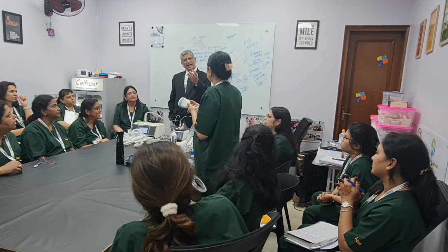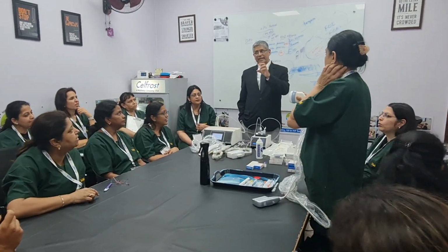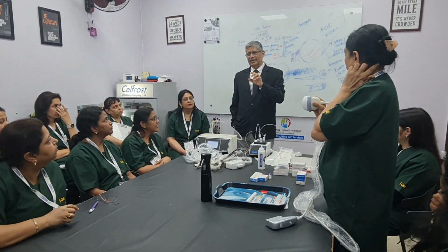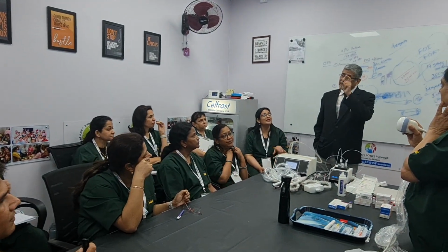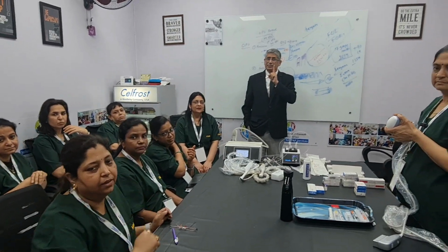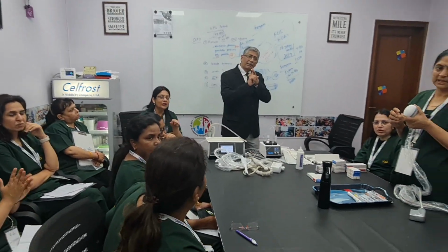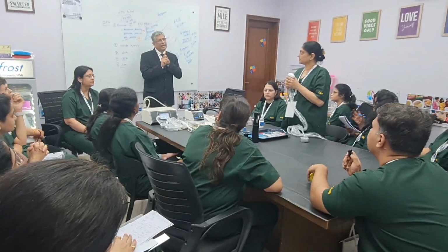With a higher frequency, the depth is less. That's why TVS has more hertz, so more clarity but less depth. Penetration will come down, but the clarity will increase.